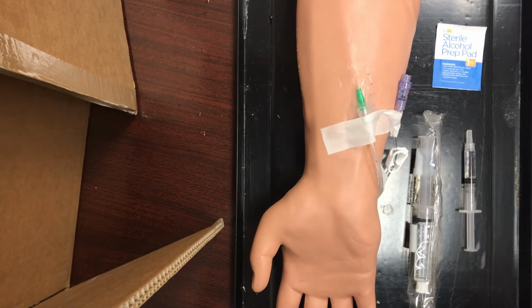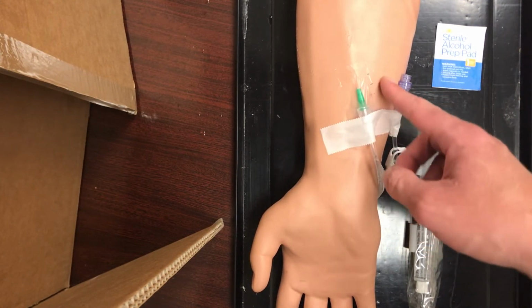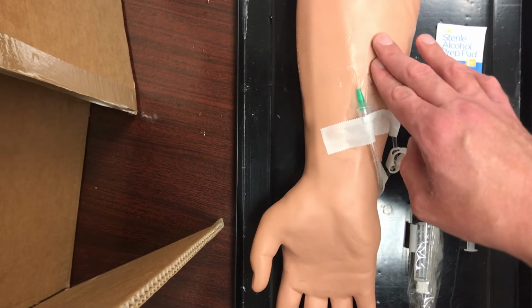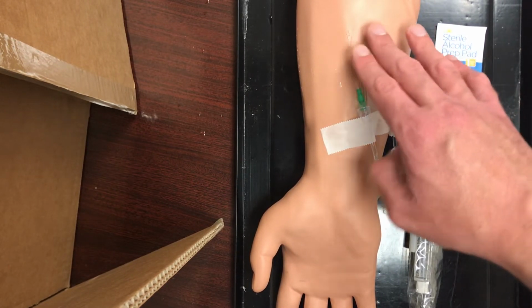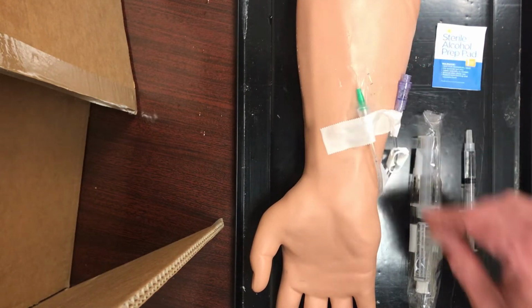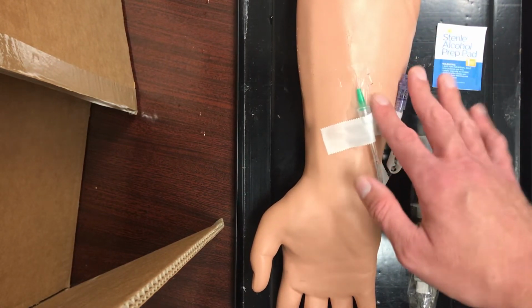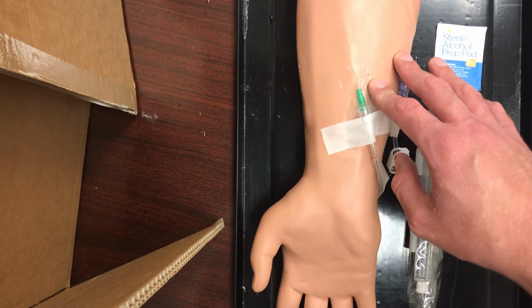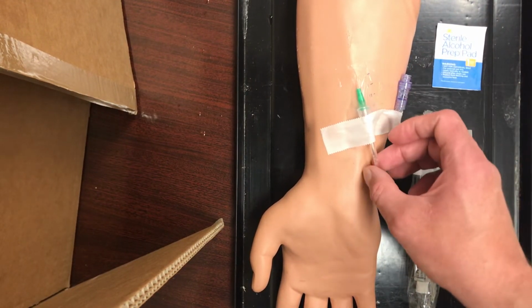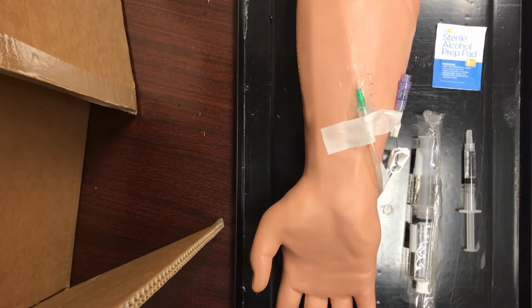Typically, we'd also assess for infiltration. Around the site, if you notice any infiltration, you'll notice swelling, but it'll be either pale or what they describe as a pallor color, which can even be somewhat of a gray. And then it'll also have pain in that area as well. So the swelling, the pallor, and the pain. And that could be from fluid extravasating in that area, or it could be the catheter has gone through the vein, or just because of the site, if the patient moved, if the IV had caught onto something. We just want to double check that and verify, and we'll verify with placement as well.